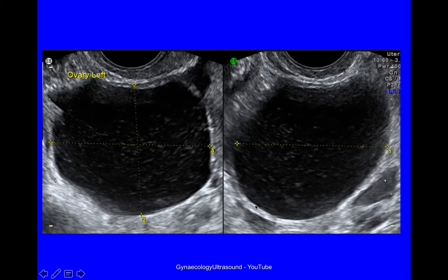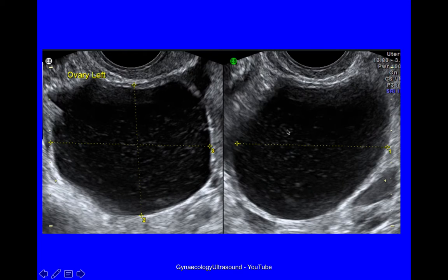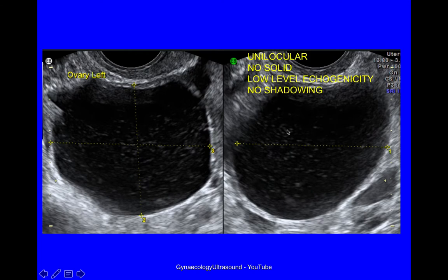This is a cyst seen in two planes — longitudinal and transverse. Again it's unilocular with no solid material, the internal cyst wall is regular. Low level echogenicity in the cyst contents and no shadowing. This shows that some serous cystadenomas can have low level echogenicity rather than be anechoic.